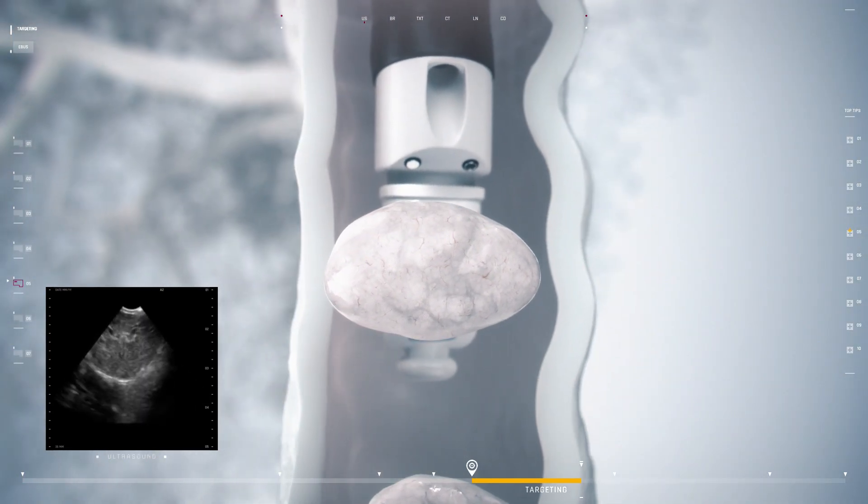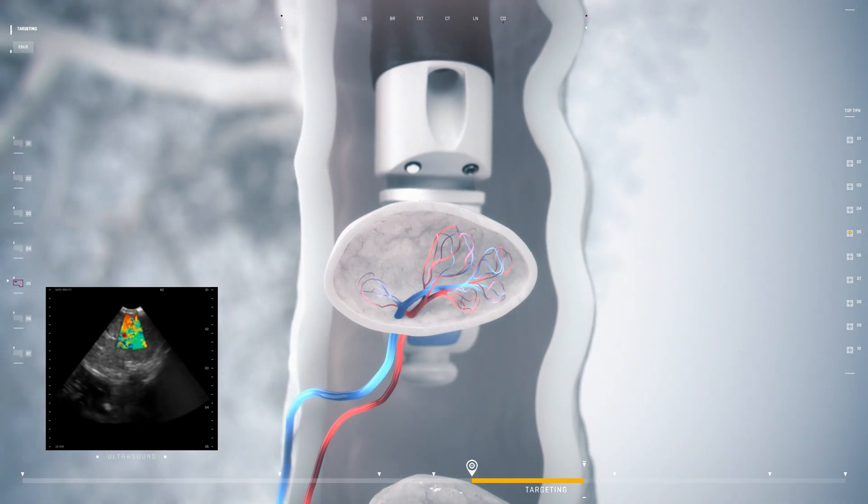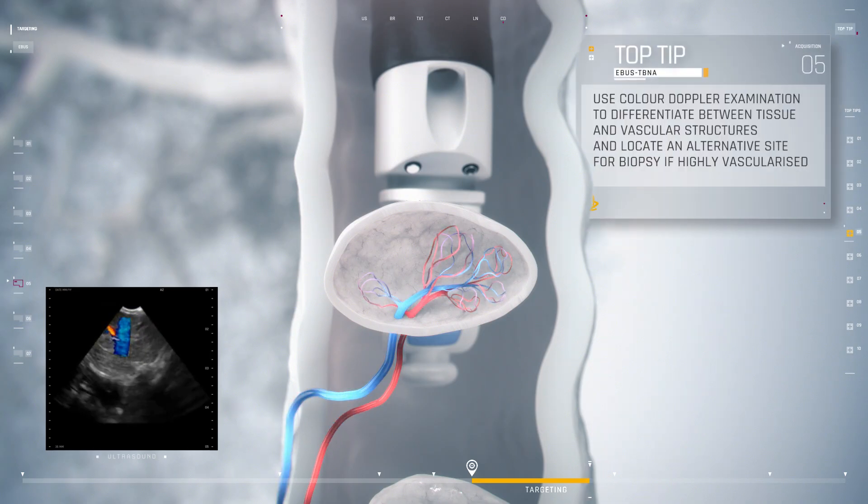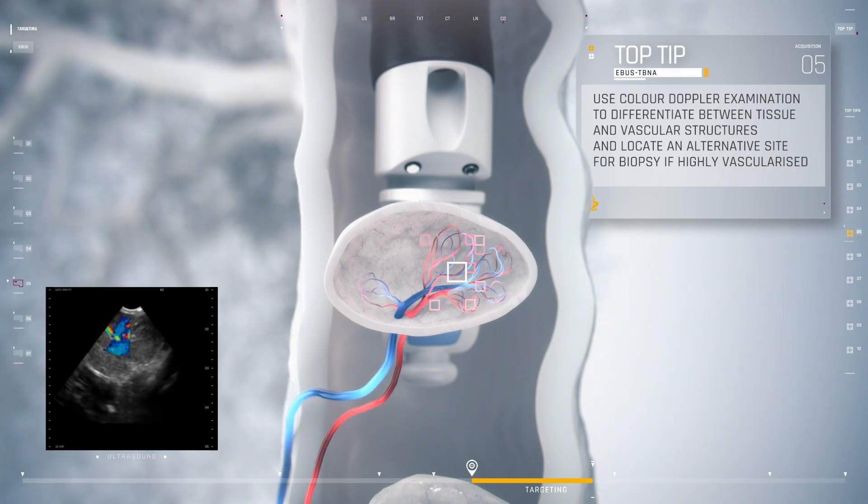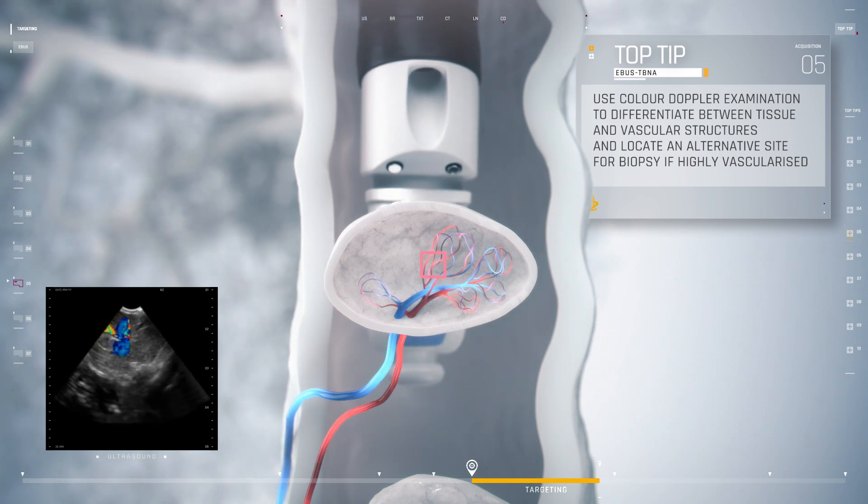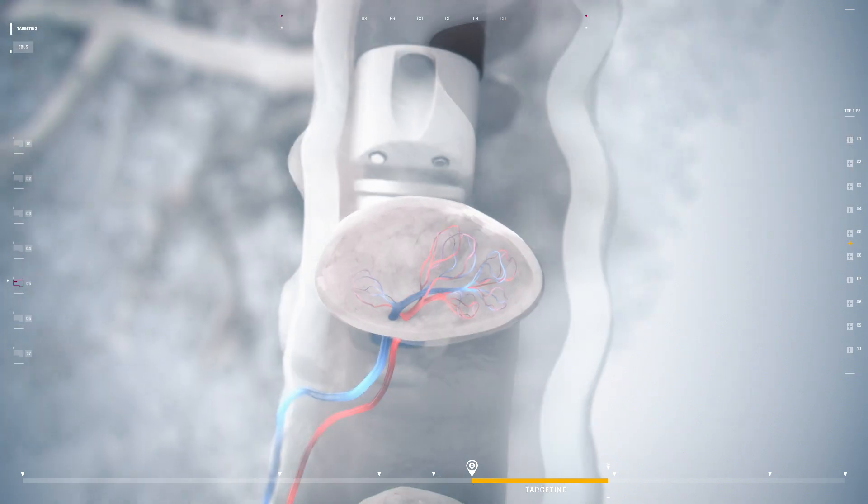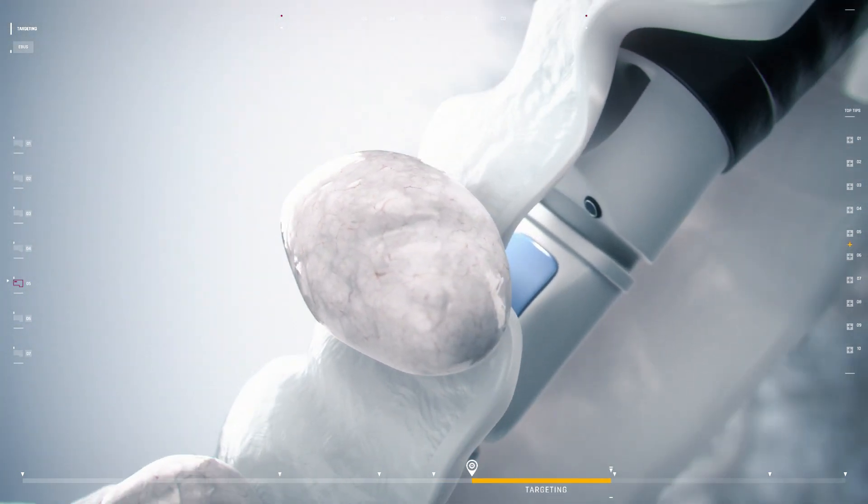Color Doppler examination can be used to support the differentiation of tissue from vascular structures. If the site of the biopsy is highly vascularized, it is advisable to locate a more suitable area of the lymph node to sample. This will minimize bleeding, which can cause contamination of the sample and blockage of the needle.